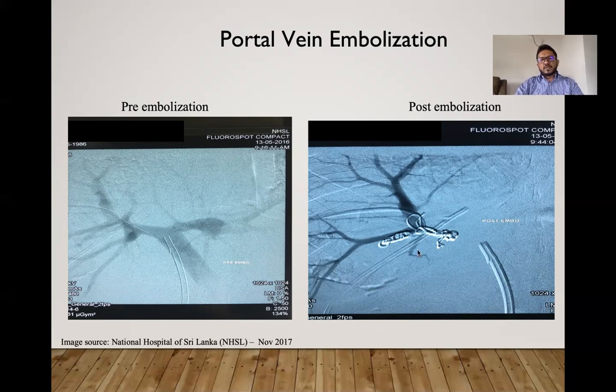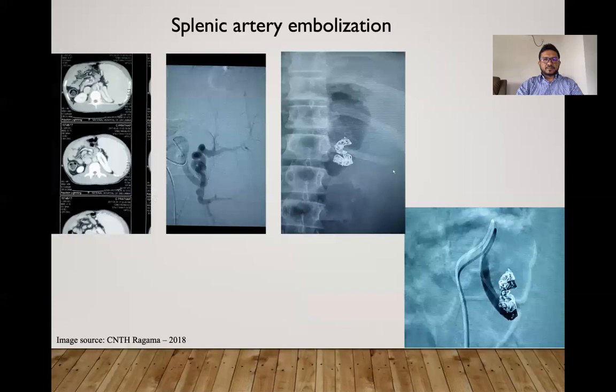where the future liver remnant is not adequate enough for survival, then you need to go in and access the portal vein and embolize. You can do it ipsilateral or contralateral. It's always preferred to do ipsilateral because then the damaged part will be anyway removed. So the contralateral portal veins are preserved and no damage has been done.